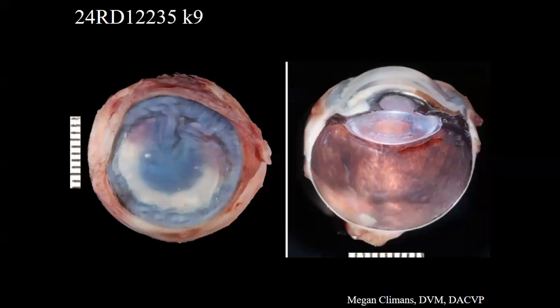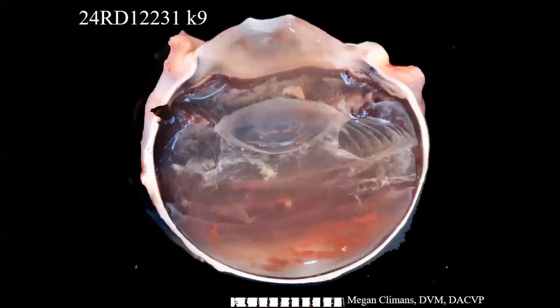Ryan here, on the comments online, said we could send him some additional unstained slides for some IHC if you want, and he suggested urothelial nature as a possibility. Yeah, the way that they have the kind of umbrella shapes in some of those areas. Yeah, I wouldn't be surprised. So we might take you up on that. And for what it's worth, we don't have any more follow-up on this patient. Don't know what happened to this patient after this diagnosis. Not a good diagnosis, unfortunately.